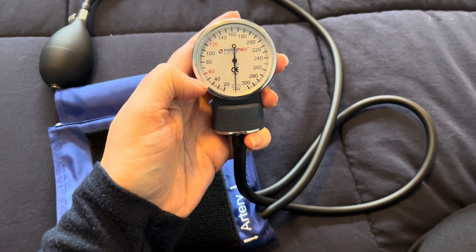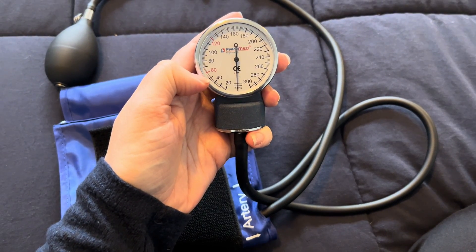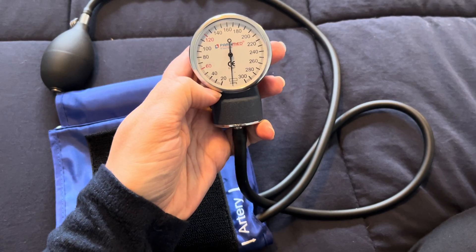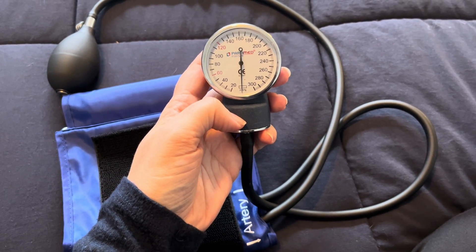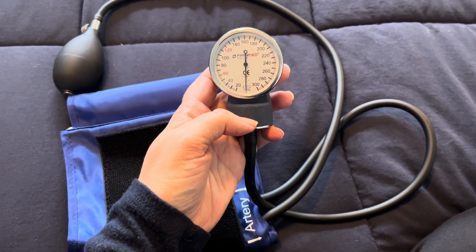It was very easy to learn how to take blood pressure by using this, and I highly recommend it. I hope that you enjoy it and that it helps you in whatever you're doing.